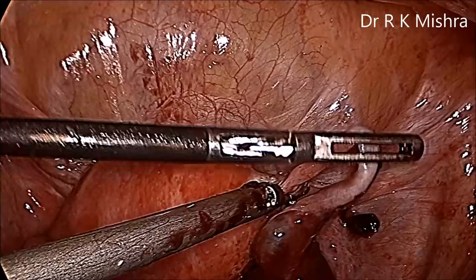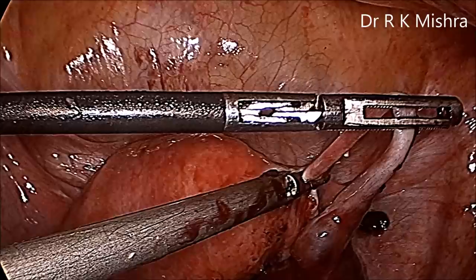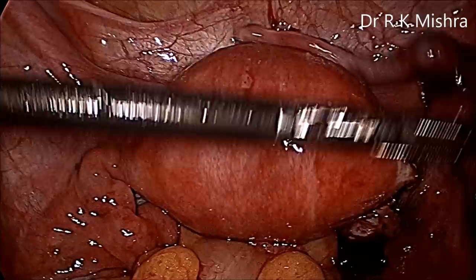So 6 mm of the tube should be nicely coagulated using minimum vibration of the harmonic, and then it can be separated easily. The specimen is kept over the anterior cul-de-sac.